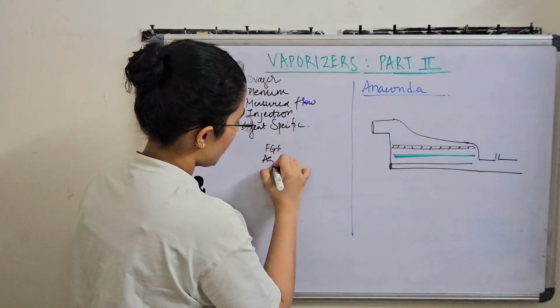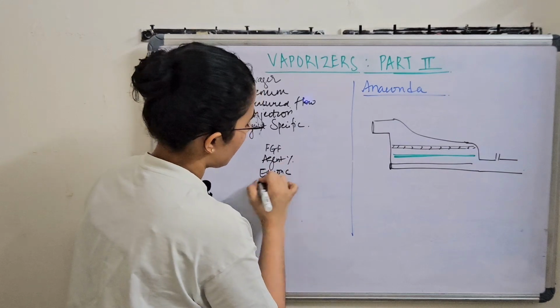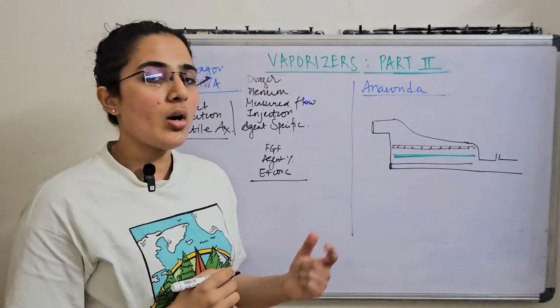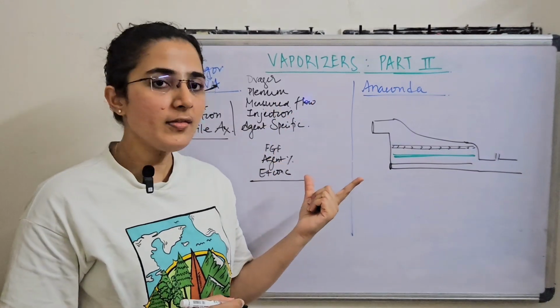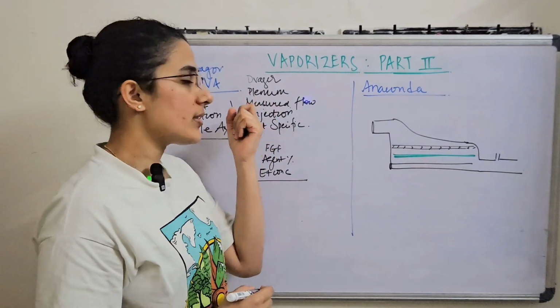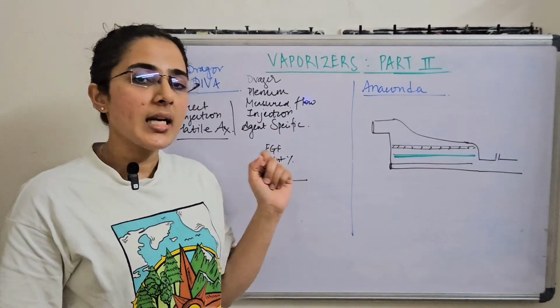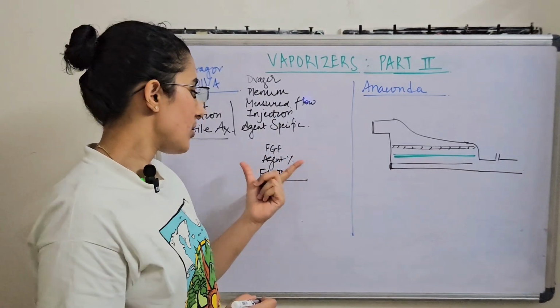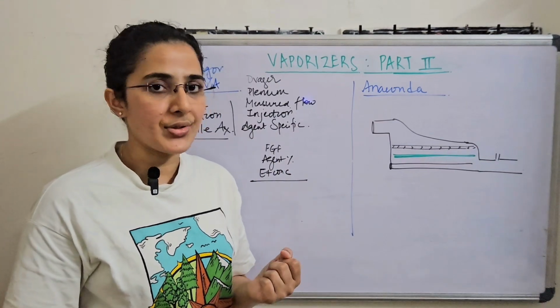We set up the agent concentration or the end tidal concentration of the agent, and automatically, within this chamber itself, the vapors of the volatile anesthetic agent are injected in order to ensure the set end tidal concentration of the particular agent.